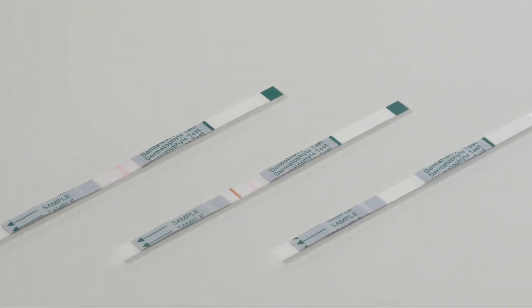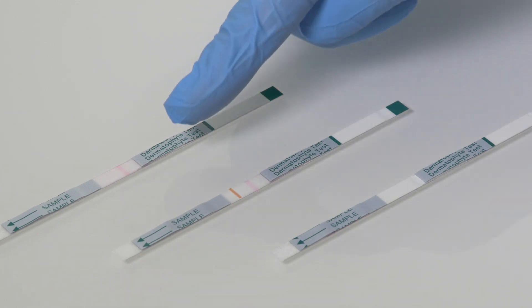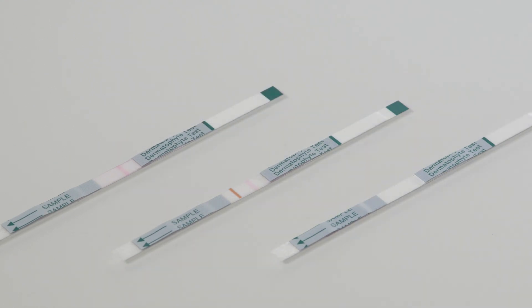There are 3 possible outcomes as shown in the 3 test strips here, following the test. Firstly, a single pink line. This indicates the test has been successful, but is a negative result. There is no Dermatophyte nail infection within this sample.